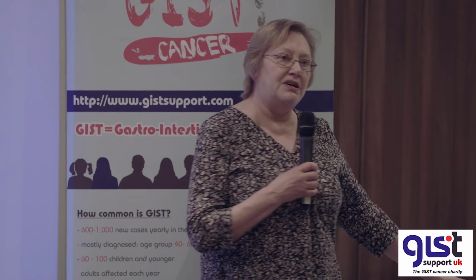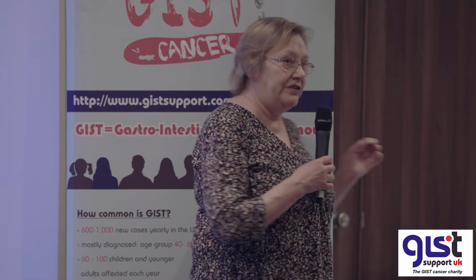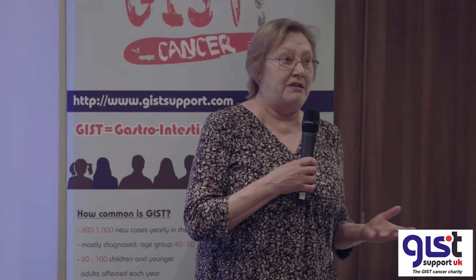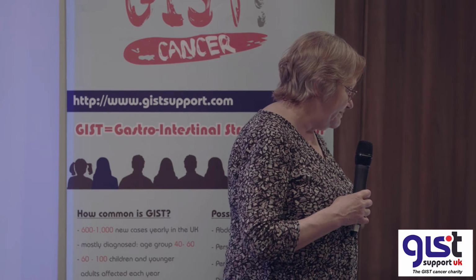They've got another sort of measurement for PET, and it's called PERCIST. Rather than measuring diameters, it measures the amount of uptake. SUV is the standard term. It's called standardised uptake value, and it's a surrogate for the amount of metabolic activity. So similarly, partial response will be a 30% decrease in SUV, and progressive disease is a 30% increase. So similar criteria. So that's basically how we measure things.